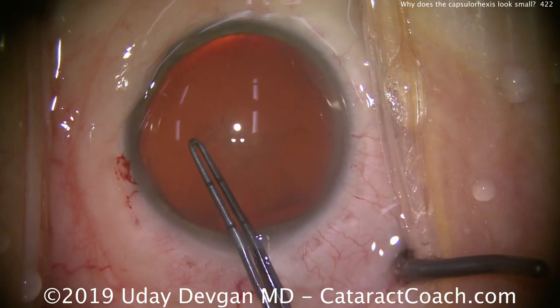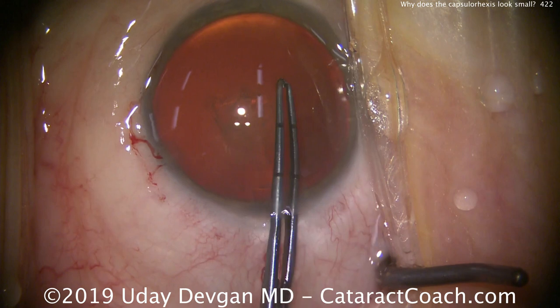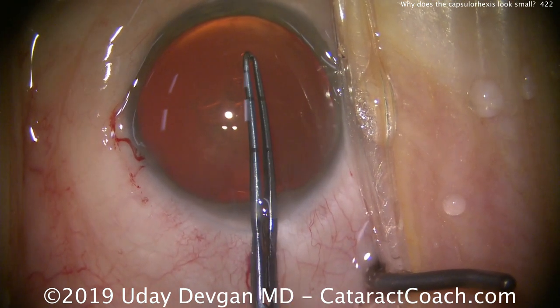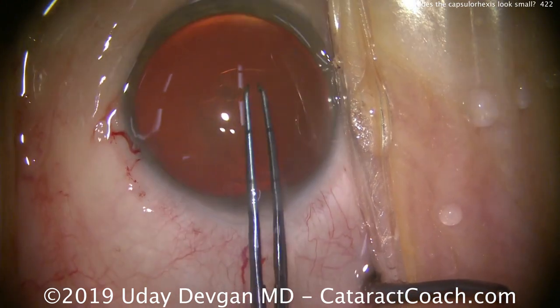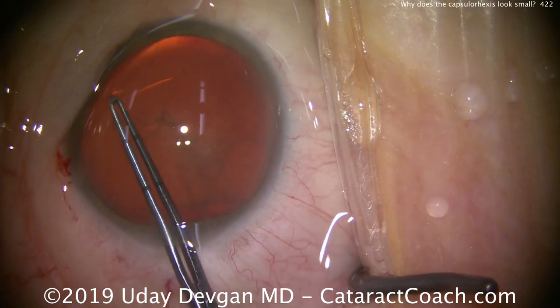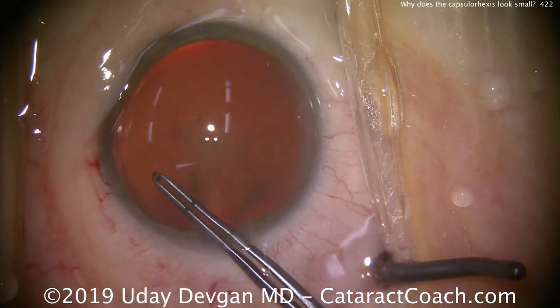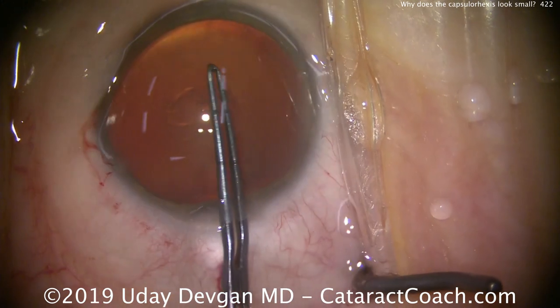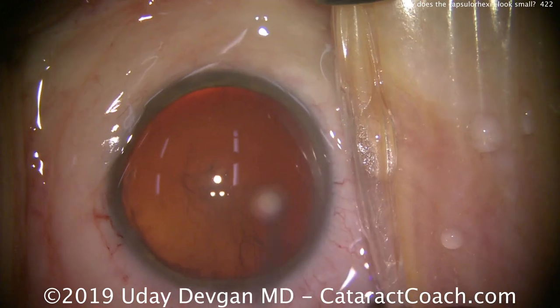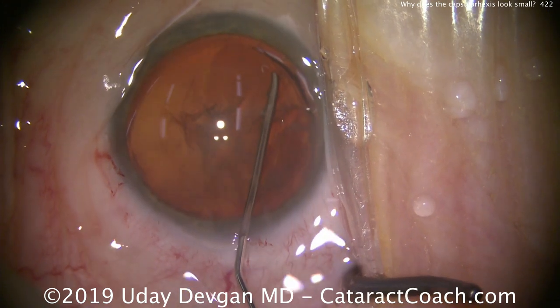This patient has a very thin capsule, and it's also a very big eye with a very large anterior segment. The white-to-white measurement is quite large, about 13 millimeters, with a massive dilation of greater than 10 millimeters. When we make this rhexis, look at the forcep tips — marked at two and a half and five millimeters from the tip. When I measure this rhexis, it actually is okay — that's a five millimeter capsulorrhexis. It just looks so small because this eye is so big. This is a very myopic eye.